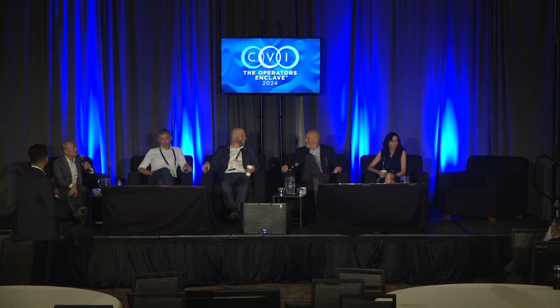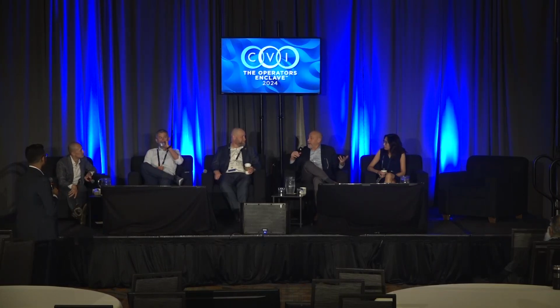Yeah, if it's a Brock needle, it's surprising how it closes. Believe it or not, out of pure ignorance and maybe listening to the wrong people, the first several I did were 5 French, and I just pulled it out and walked away and didn't go round later in the day, so everything was fine. The other key is, whatever you do, do not tie the sheath down or hold it as you're doing these procedures, because of the movement of the LV, you need everything to move with the heart. Otherwise, it will cheese slice the apex.